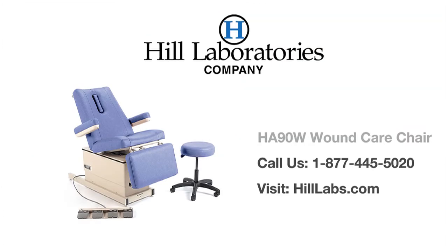The Hill Laboratories 90W is the only chair specifically designed for wound care. Hill Laboratories has been a leading manufacturer of chiropractic, physical therapy, and medical treatment tables since 1945. For questions and ordering, call us toll-free at 1-877-445-5020 or visit hilllabs.com.